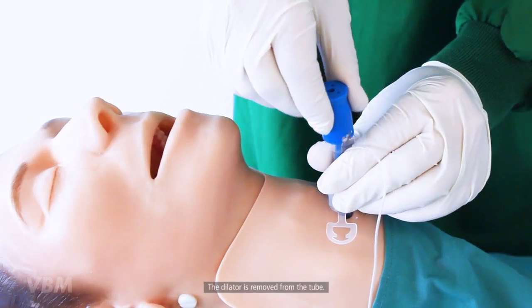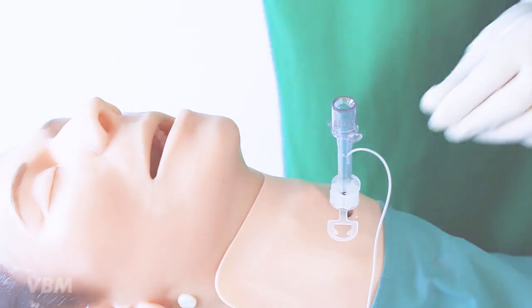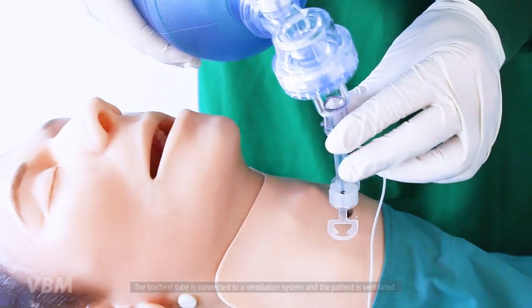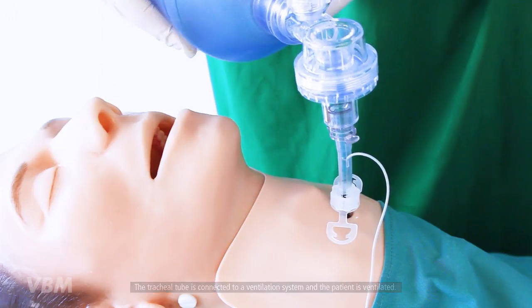The dilator is removed from the tube. The tracheal tube is connected to a ventilation system and the patient is ventilated.